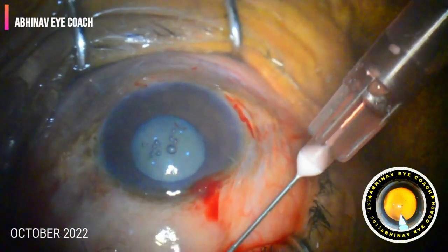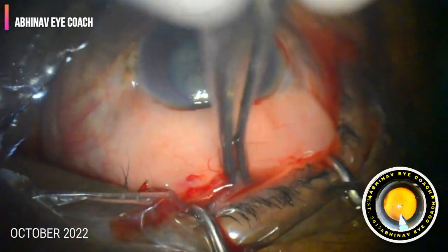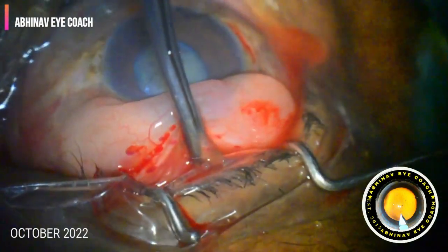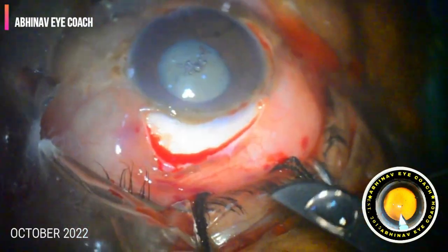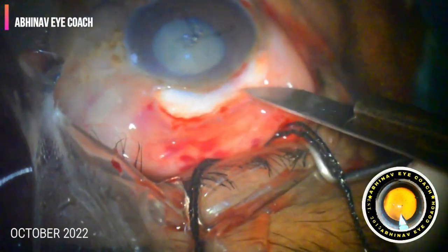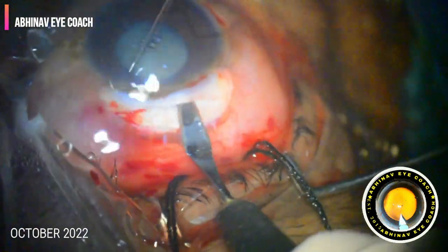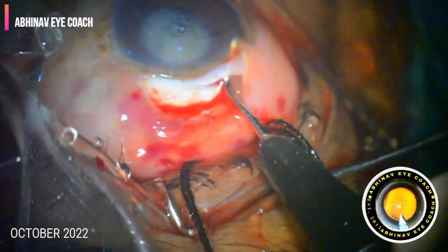At this moment I planned to convert the case into manual SICS, so I gave local anesthesia to keep the patient comfortable. As you have seen, I had already enlarged the capsulorhexis into a much bigger one, so that it would allow delivery of the nucleus into the anterior chamber.